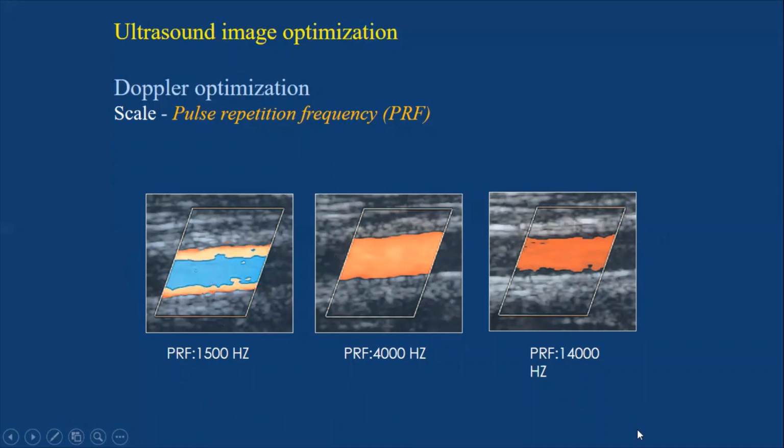And what we are seeing now is the loss of flow in the part that is flowing nearby the vessel wall. Why does this happen? Because this is the slowest flow along the vessel lumen, because of the friction of flow with the wall. It will become slow at the wall and very fast in the center, again slow at the wall. So raising the PRF will sacrifice the slow flow everywhere. In this case, it includes the slow flow along the vessel wall.